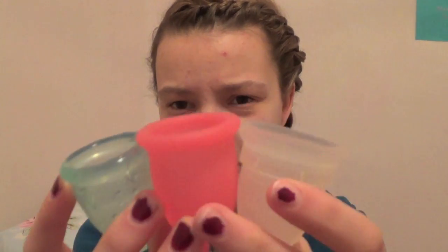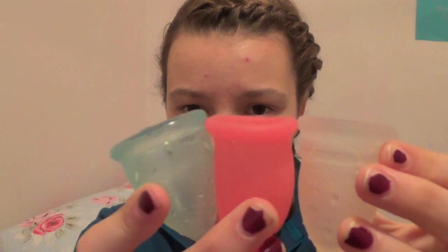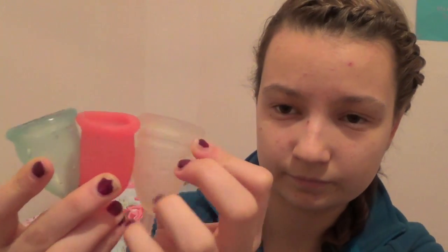The next thing is it could be a bad shape. You can see here there are many different shapes of menstrual cup. This one has a pretty thick rim. Let me hold up on my hand the moon cup compared to the lady cup and the Cervical. The Cervical flares out a bit more up here, and then the lady cup has more of a firm rim. The lady cup's actually stiffer towards the top of the cup, as opposed to down here where it's softer.